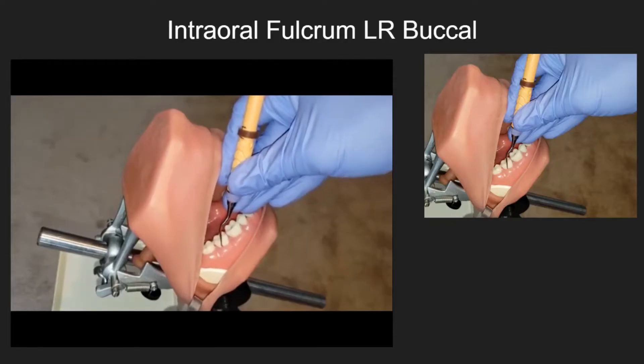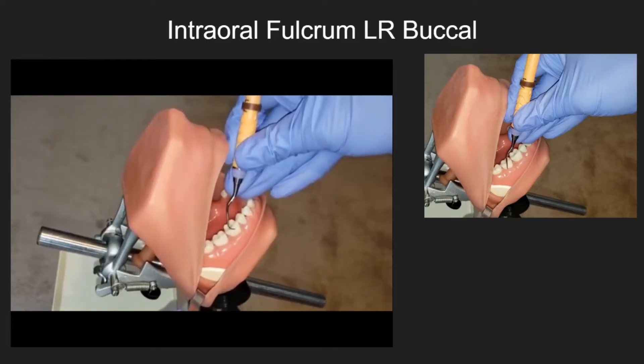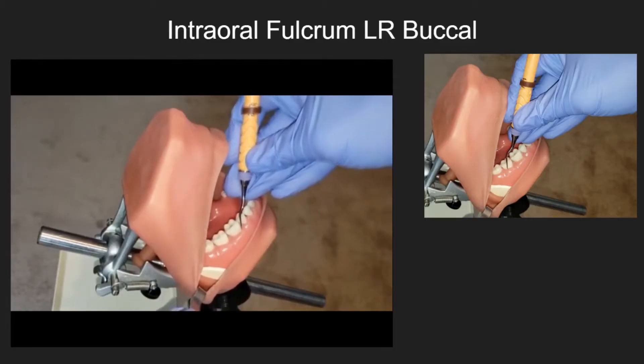Intraoral fulcrum — lower right buccal. Notice how the clinician maintains a modified pen grasp and pivots up on the fulcrum when approaching the mesial line angle of the posterior teeth.